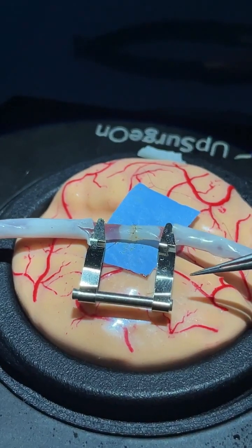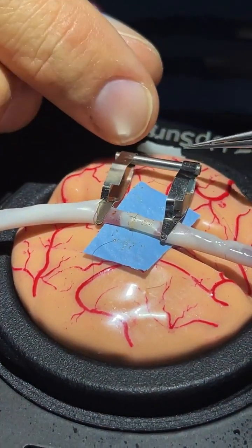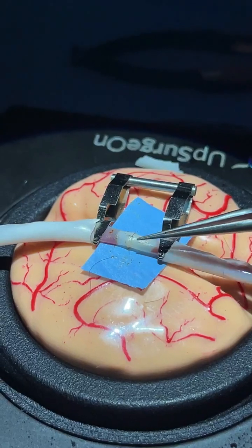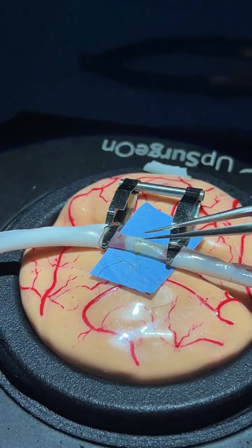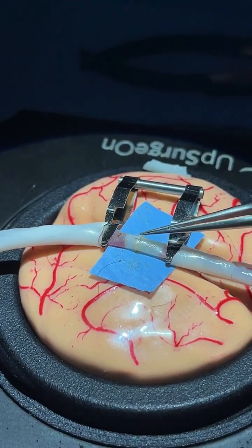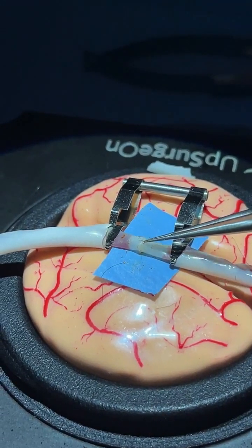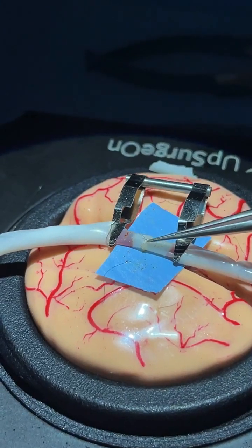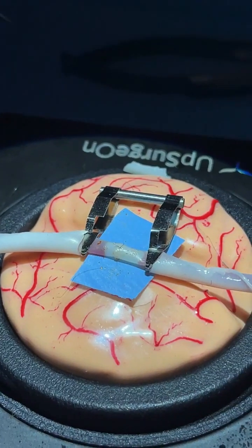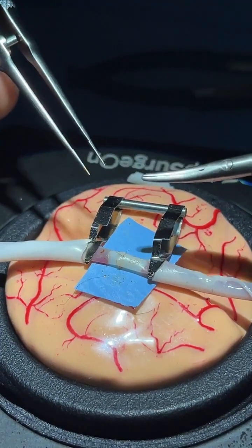Go back on the posterior wall, since we are working on the posterior wall, and start to put the stitch here. You have to imagine this is a true one-millimeter vessel — it is strong enough to manipulate, but you should try to manipulate it only using the stitches, because that way you don't create damage on the vessel.